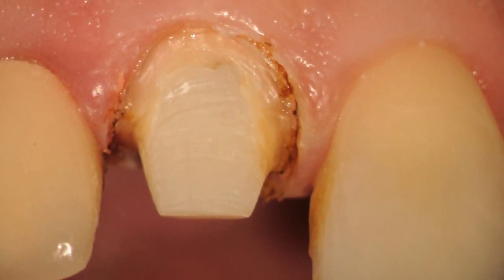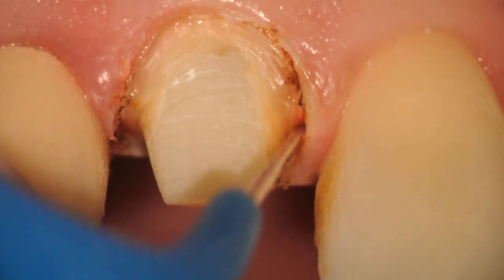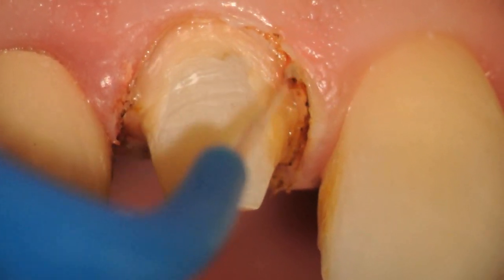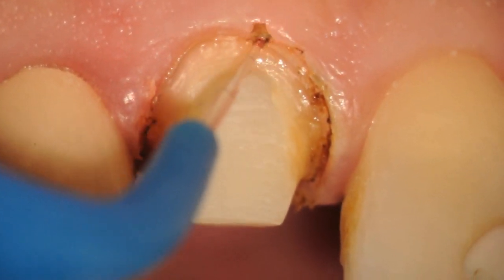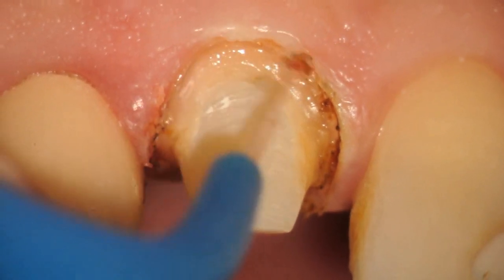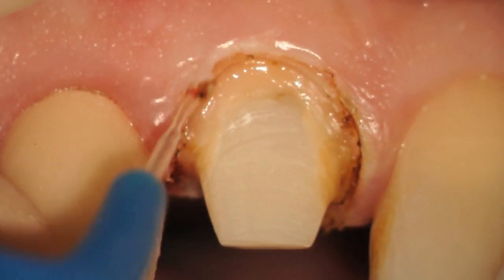You can see some brown debris, which can at times be charring, but can also be organic debris on the tooth structure that turns brown. This has become a concern for some people regarding how to clean the tissue and address the brown charring on the tooth.